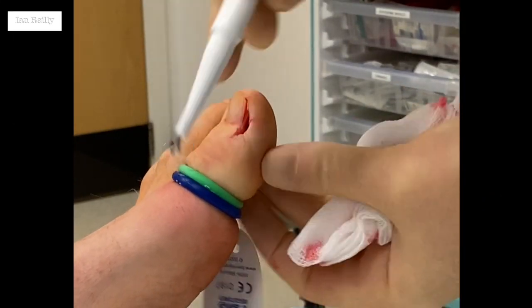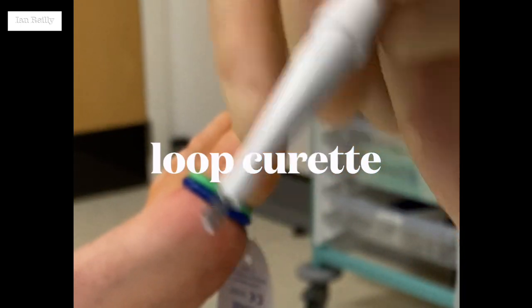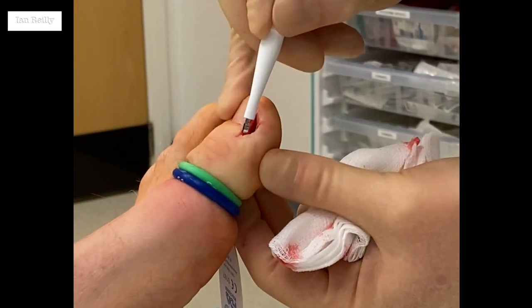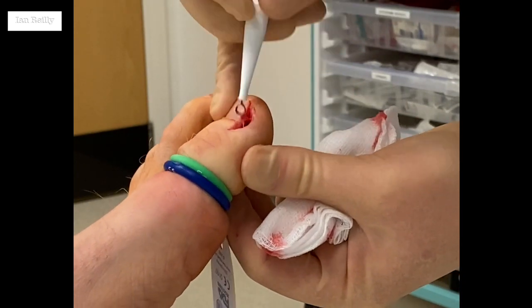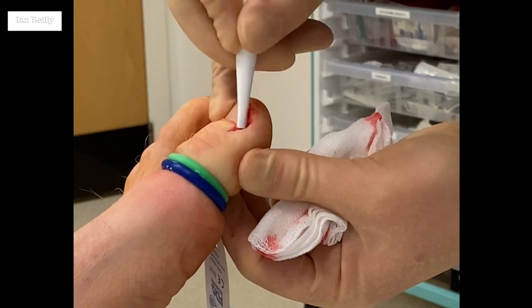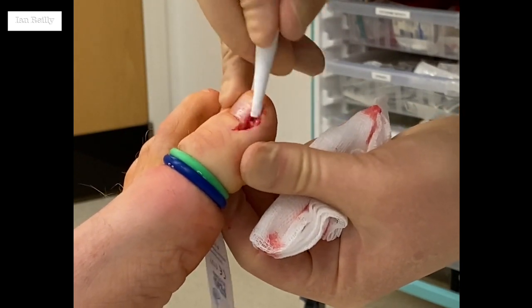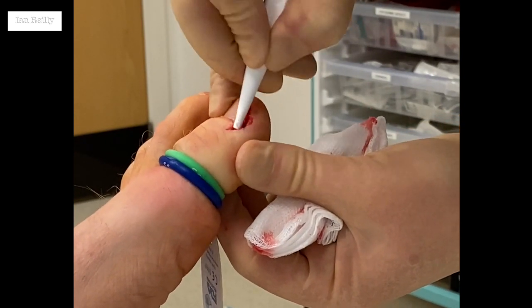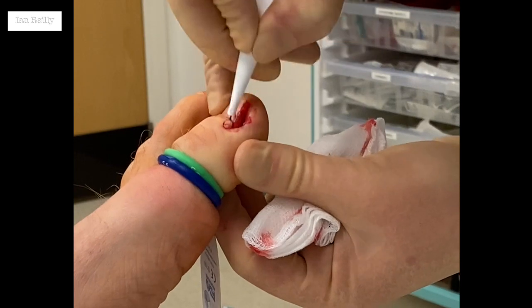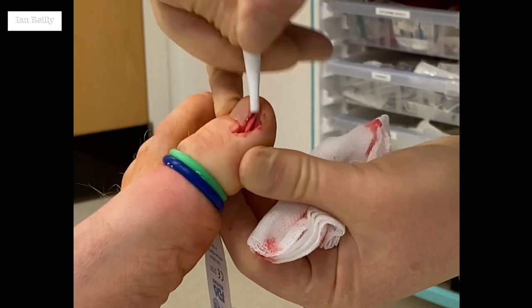Different versions. So you can just see — these are actually quite sharp and we use these for doing some of our skin scrapes — but it just allows me to get on that mesial side because it's quite scarry in there. So you want to be all the way down to bone and get all that soft tissue out, because this is the bit of root you can miss.